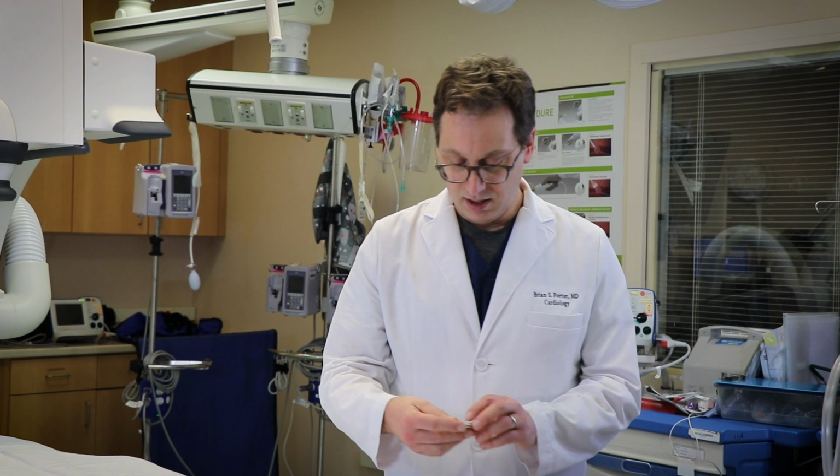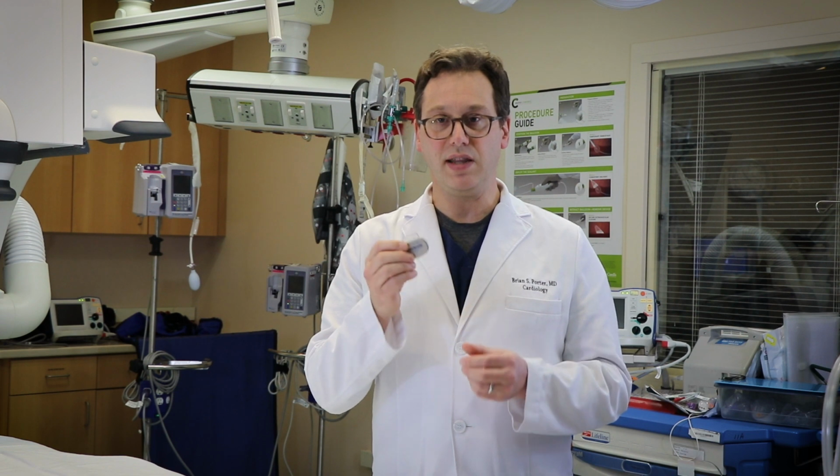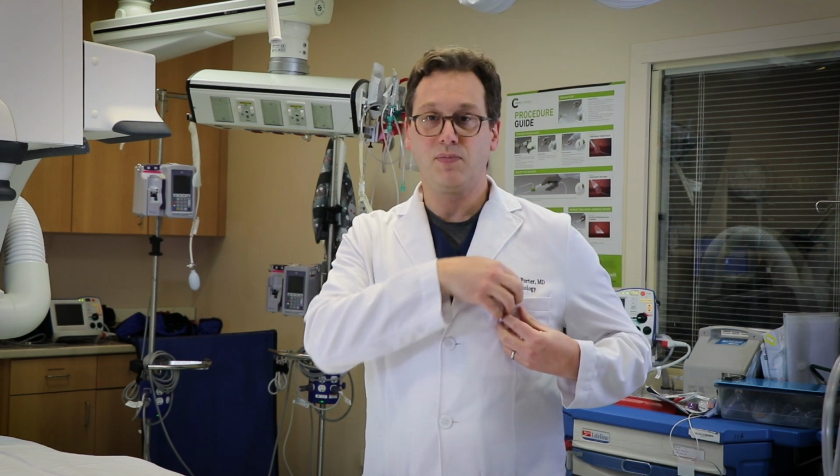Now, I have some examples of cardiac pacemakers here in front of me. A cardiac pacemaker is about the size of an Oreo cookie, so it's even a little bit smaller than that Zio patch. The cardiac pacemaker is implanted under your skin, usually in the left upper chest area or sometimes in the right upper chest area, generally in the area where your chest pocket would be. So I have a chest pocket on my coat. The pacemaker fits under the skin just like this, and it's stitched in place. Once it's installed, you can't really see it. You can sometimes feel it, but it's hidden under the skin.